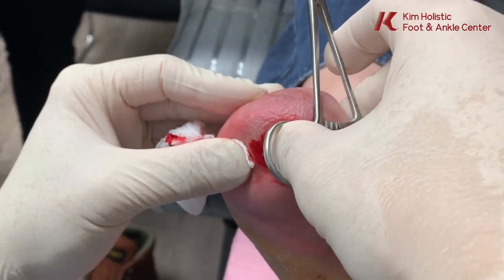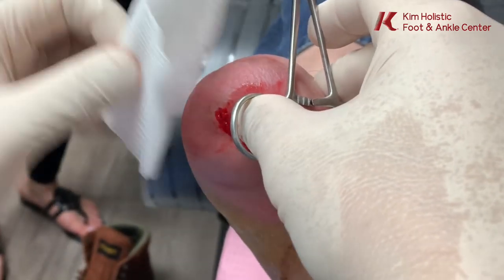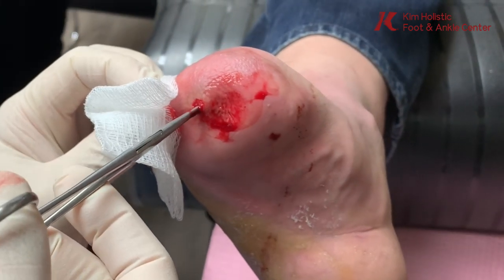You feel that? No? Okay. It's kind of moving — yeah, he feels it jiggly. So I'm gonna see if there's anything foreign in there.